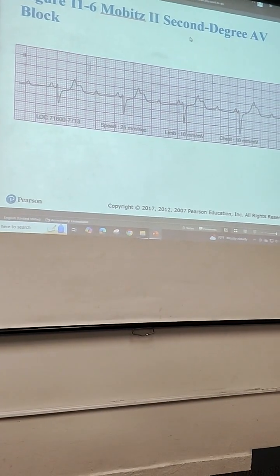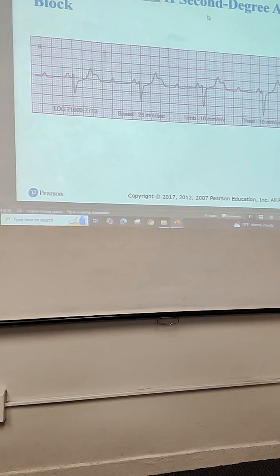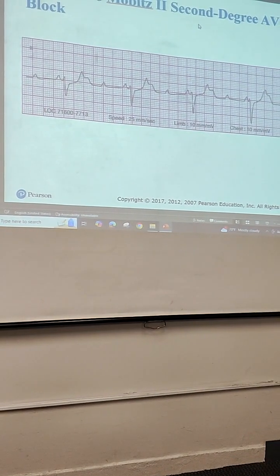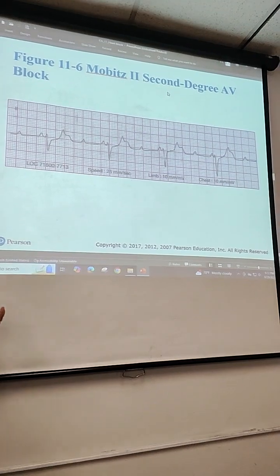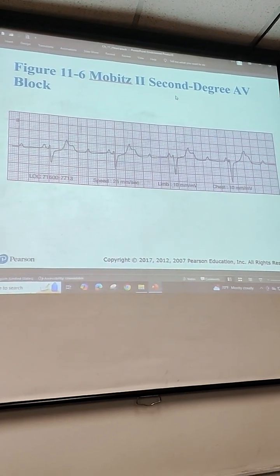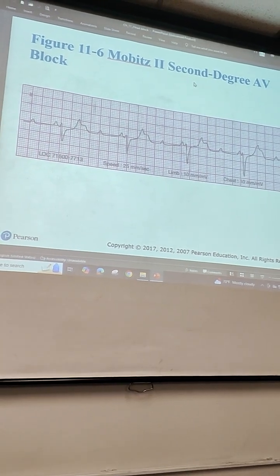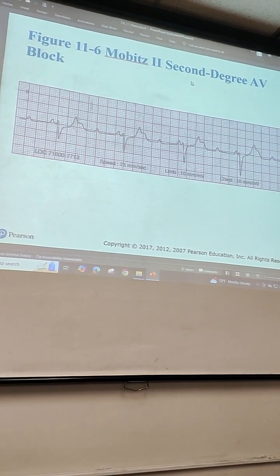One that I'm going to show you next. But type 1, remember, is a prolonged PR interval. Usually they give you the definition. You see on an EKG a prolonged constant PR interval. Immediately, you don't have to see numbers. As soon as it says prolonged constant, you know that this is first degree AV block. Period.